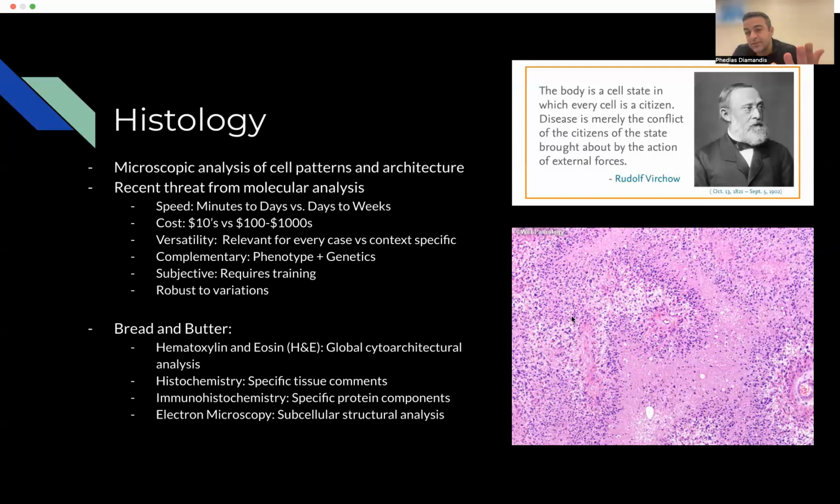As we saw in normal brain tissue in one of the earlier slides, it's much more cellular. They're much more disorganized. So we know that the citizens have been invaded by a tumor. But when you look further, you see that these tumor cells are forming palisades around this pink area. This pink area that has no nuclei, because nuclei stain purple, is necrosis.